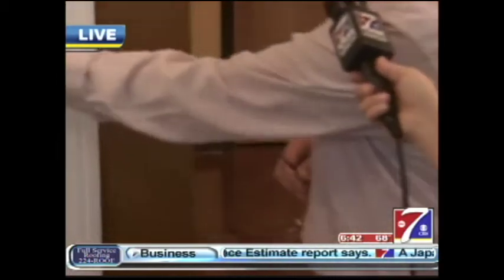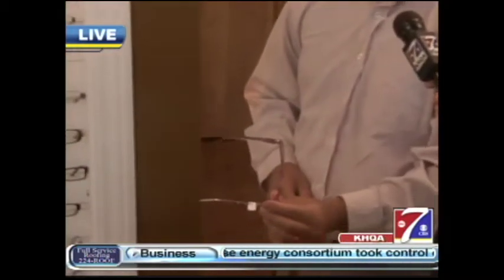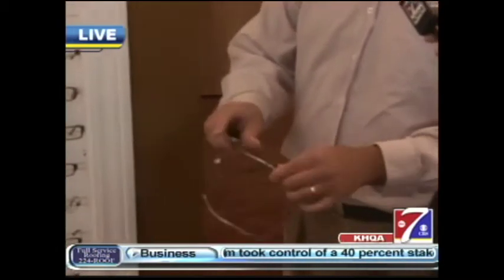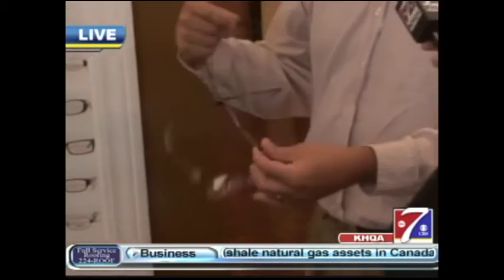Other frames that'll do that, like your plastic style frames, which are more popular these days with the little kids, they've got more design to the frame. They bend a lot easier. They're made with a certain material inside the plastic that we can heat up that bends very well to stay on their face structure. So it works both ways. I mean, it really just depends on the kids, the facial structure of the kids, and the fit. But we can definitely find something that's best for them.